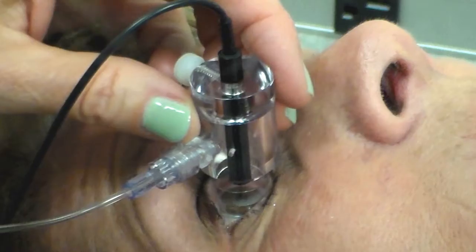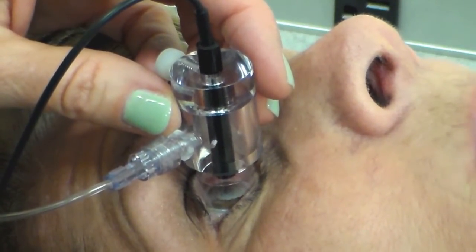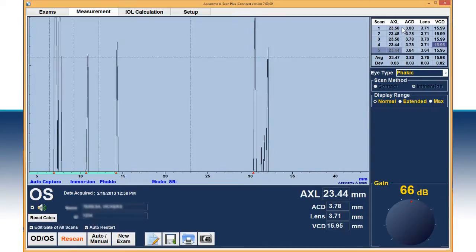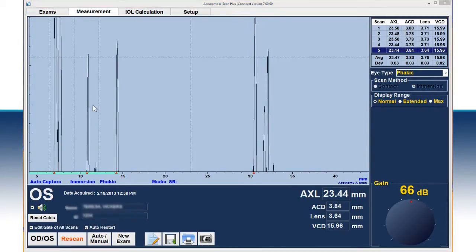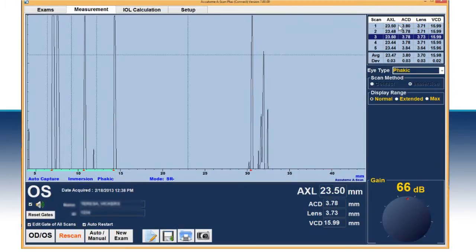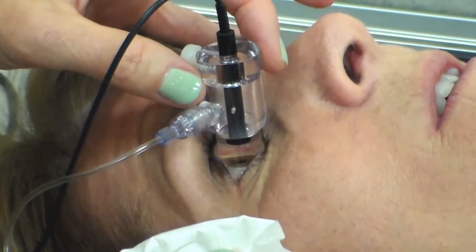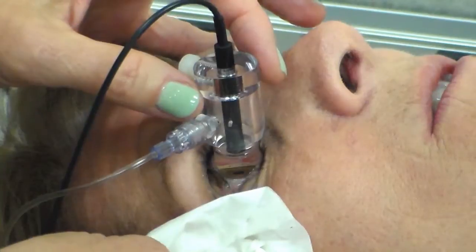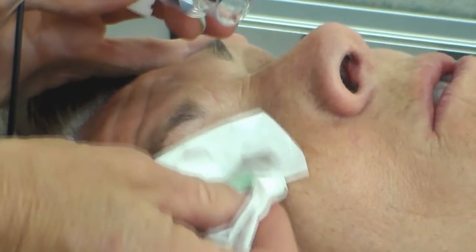If needed, adjust the shell slightly to properly align the sound beam along the visual axis in order to achieve the proper waveform pattern. The A-scan will rapidly capture five axial length measurements. Gently tap the foot pedal to review the scans. Once all scans have been reviewed and deemed acceptable, gently remove the shell from the patient's eye by tilting the shell toward the nose bridge and capturing the water in a tissue.